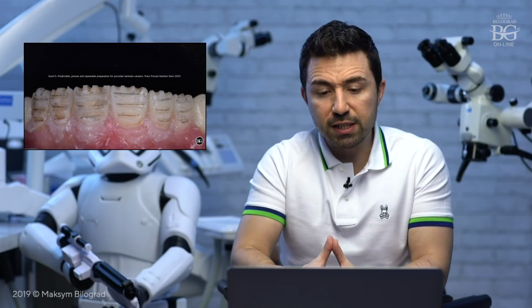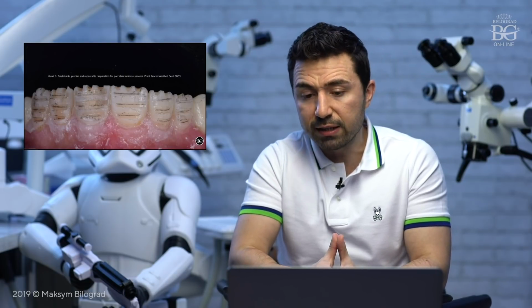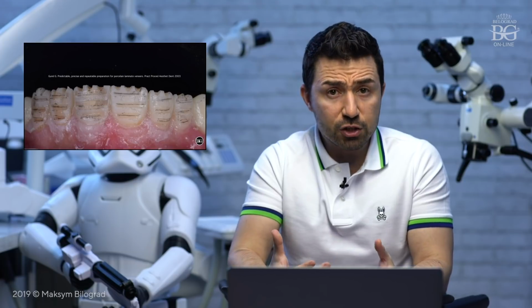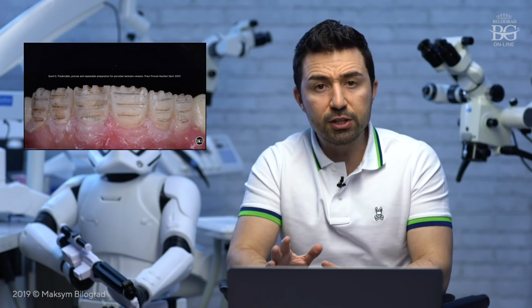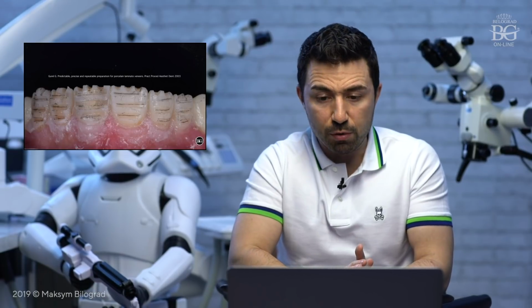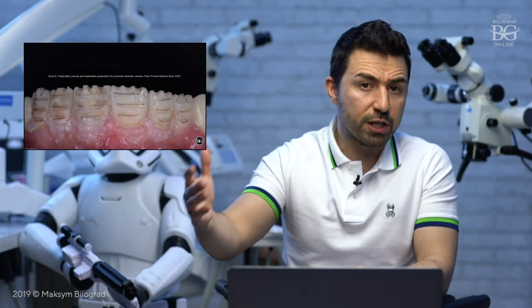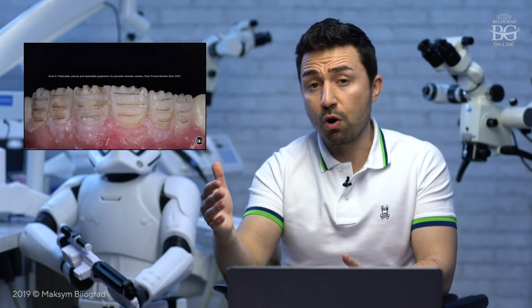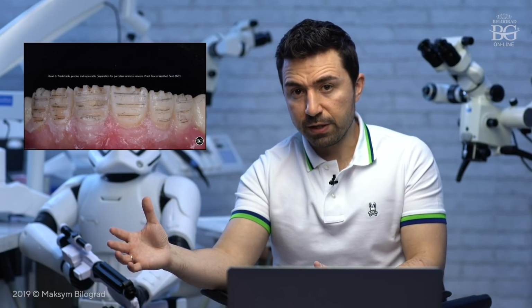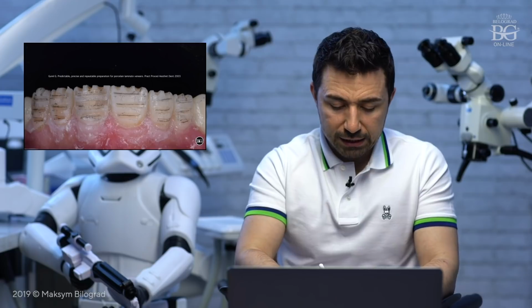The depth of preparation was driven by the dental technician's request. In this case, we changed the color, and you have to ask your dental technician regarding the thickness of material that he needs to change this color. So your dental technician will have to give you some numbers. For example, if you have A3 and you want to transfer A3 into A1, you have to give him 0.5 or 0.7 or 1 millimeter. It's up to your dental technician. You have to ask your dental technician.